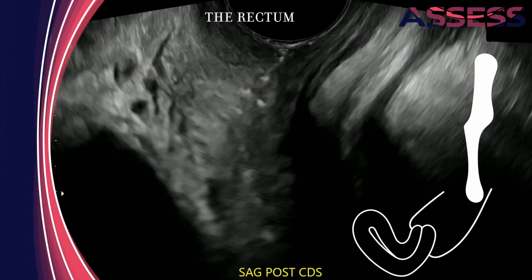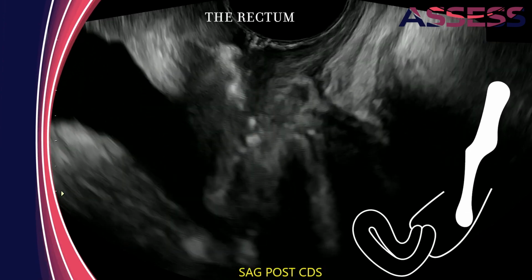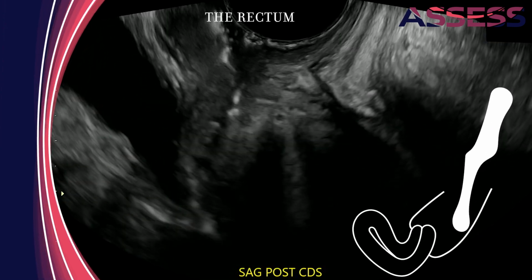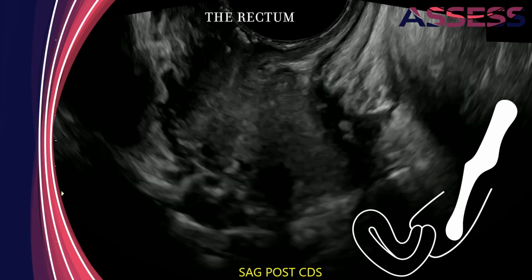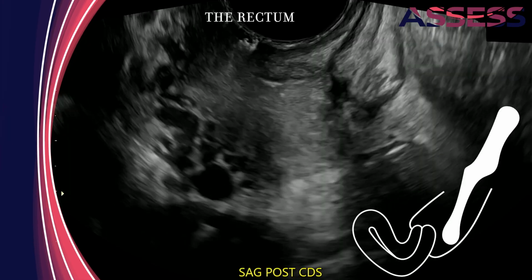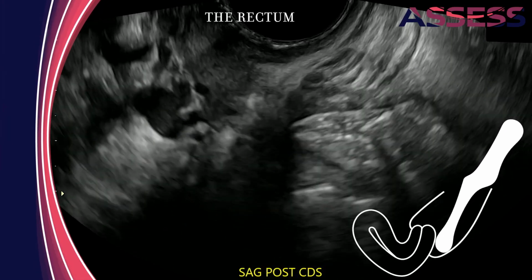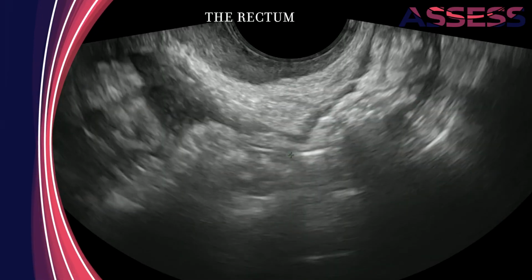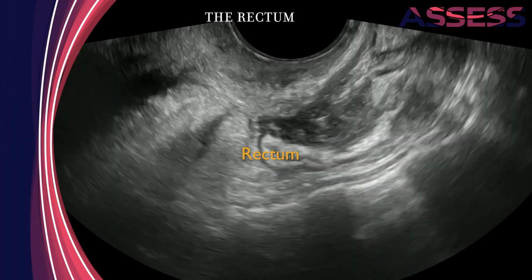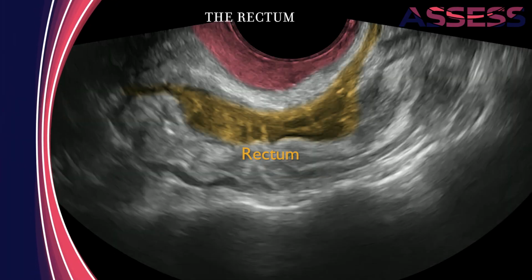As the vaginal transducer is inserted, it is possible to assess the anal sphincter and the rectum. Slowly insert the probe while angling posteriorly in the sagittal plane. Follow this section as far as possible by angling posteriorly until the probe is positioned at the top of the vagina in the posterior fornix behind the cervix. While advancing the probe in the sagittal plane, sweep from side to side to assess the entire posterior wall of the vagina, the anterior rectum, and the rectovaginal septum.